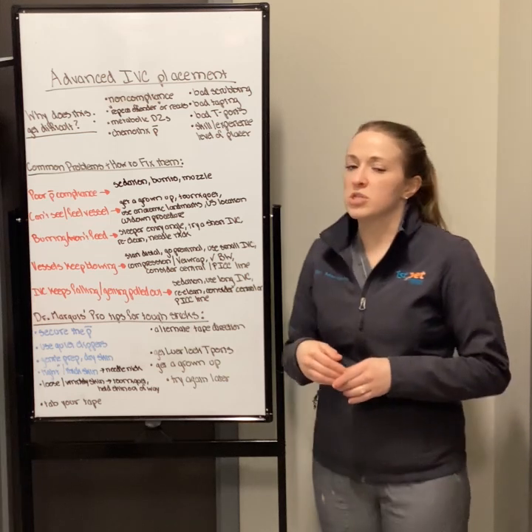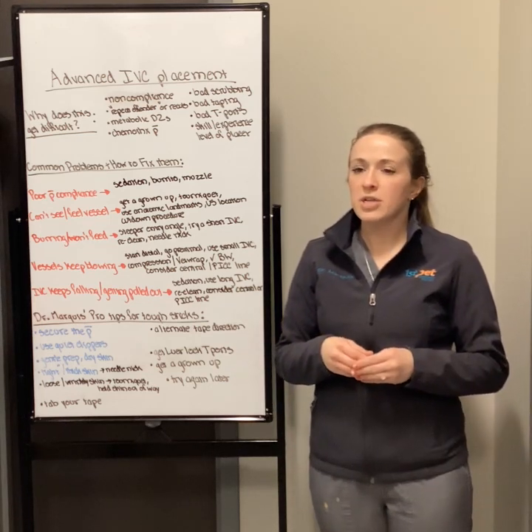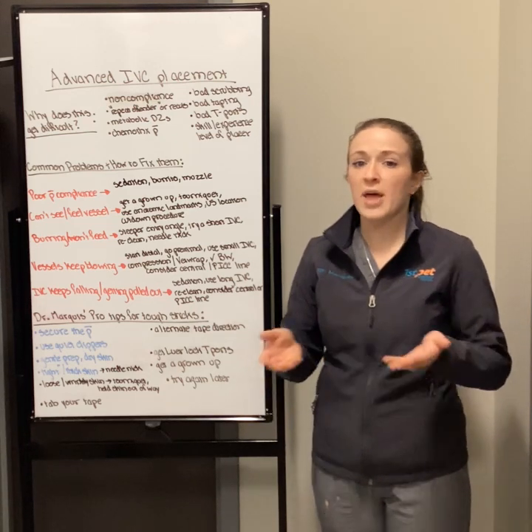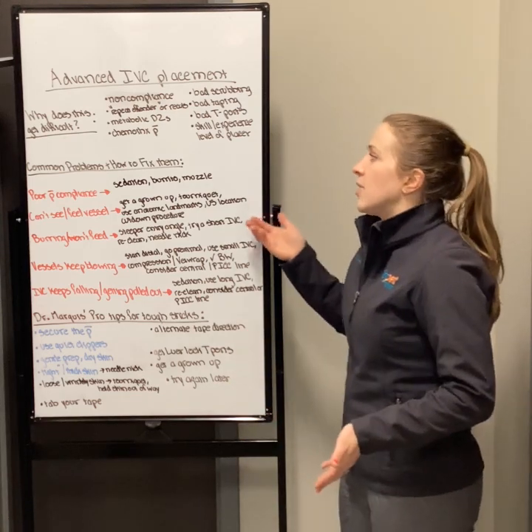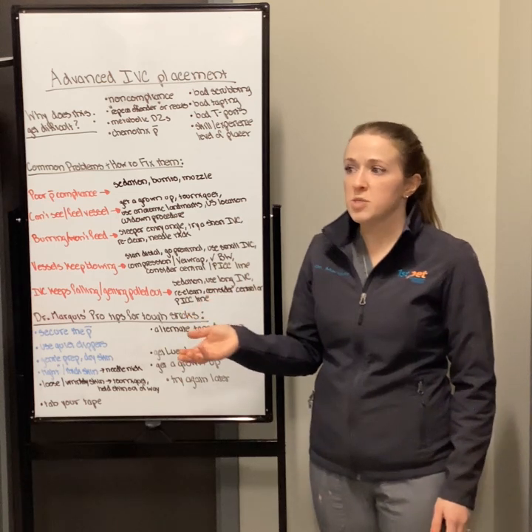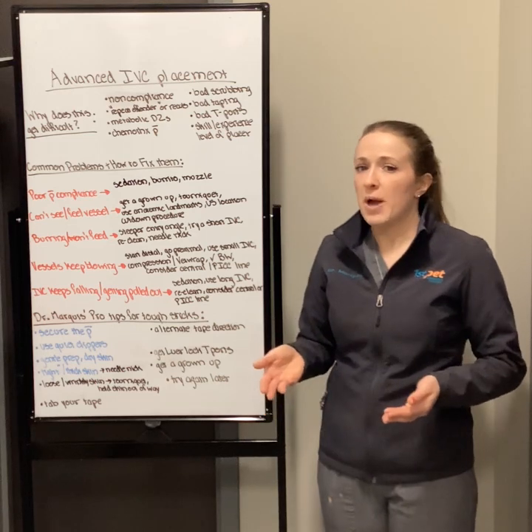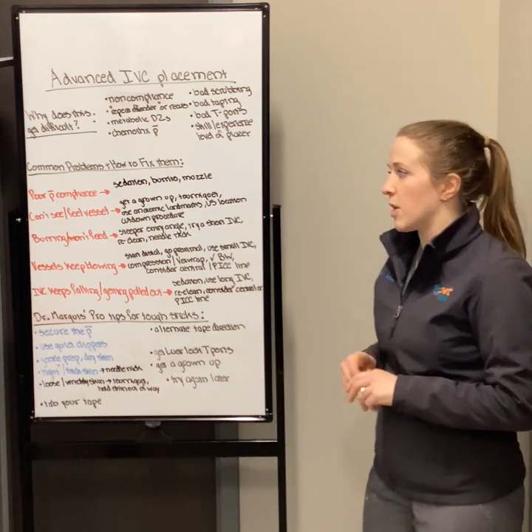Bad T-ports. If you have slip tips, no matter how you tape them, we cannot guarantee that they won't fall out. By their very nature, luer locks are going to be more secure. So that does definitely have a huge impact on the security. Skill and expertise level. Sometimes you're going to need someone who's very experienced to get this catheter in at all, and sometimes it's going to be easy enough for anyone to do. That really depends on multiple factors, but certainly that is a thing that takes part.